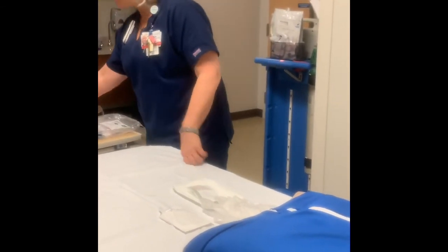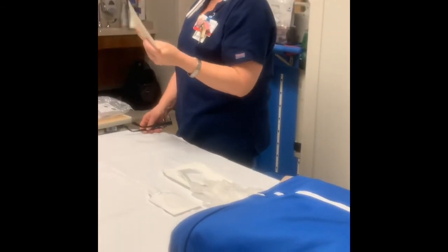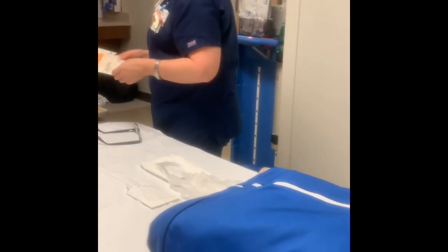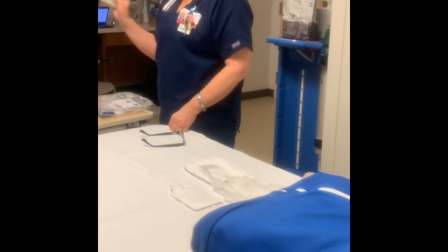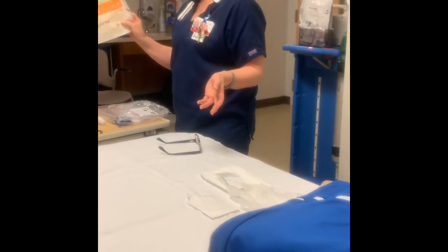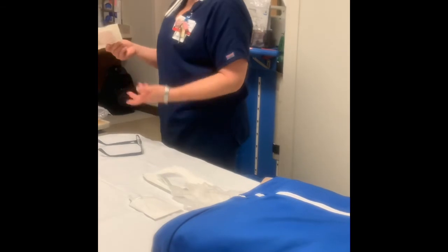But anyway, y'all might want to start looking at these a little bit. I'll order some of those. These things are amazing, and we can't keep them in stock at Gateway anymore. They're kind of special order. If you want them, you call Supply Chain, they've got the number. They know it well, because I'm always down there talking to them about these things. We end up in that situation where we're trying to clean stuff up, or if you have a patient with a PEG tube in, clean it underneath. We have a lot of that too. Those are amazing for those things.